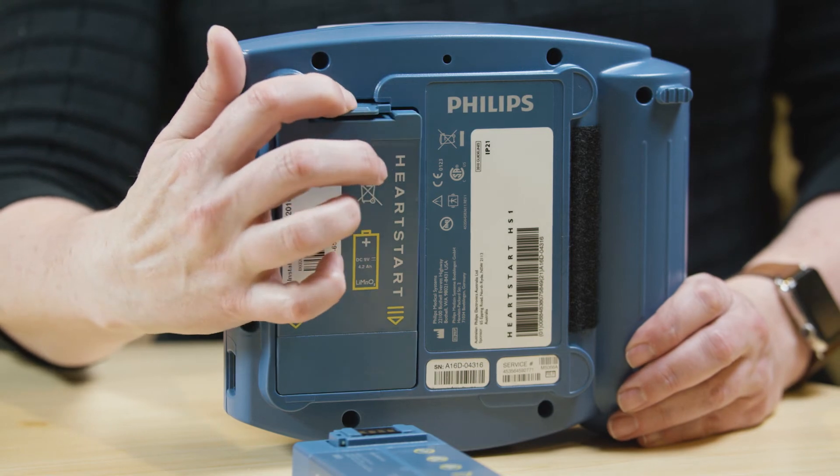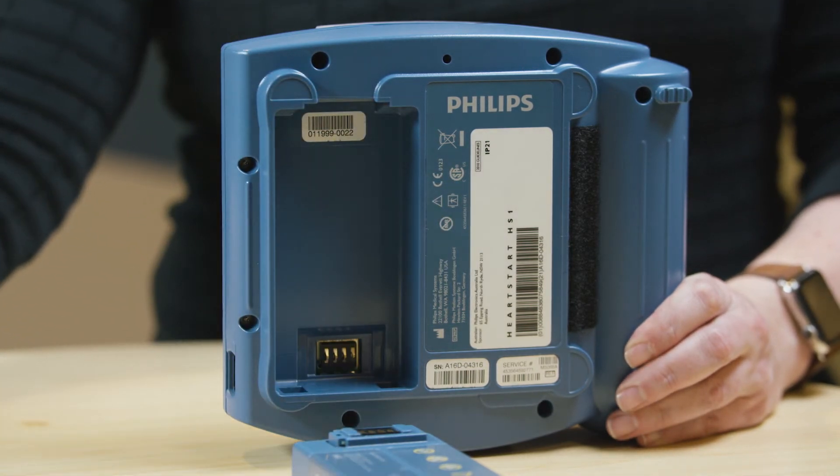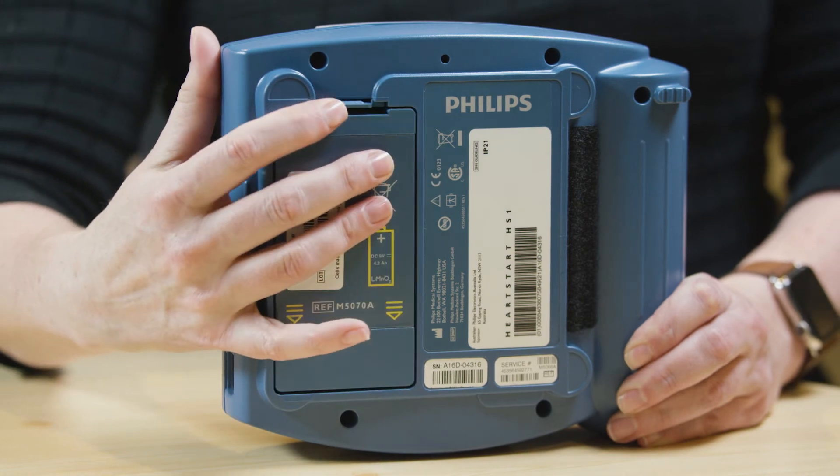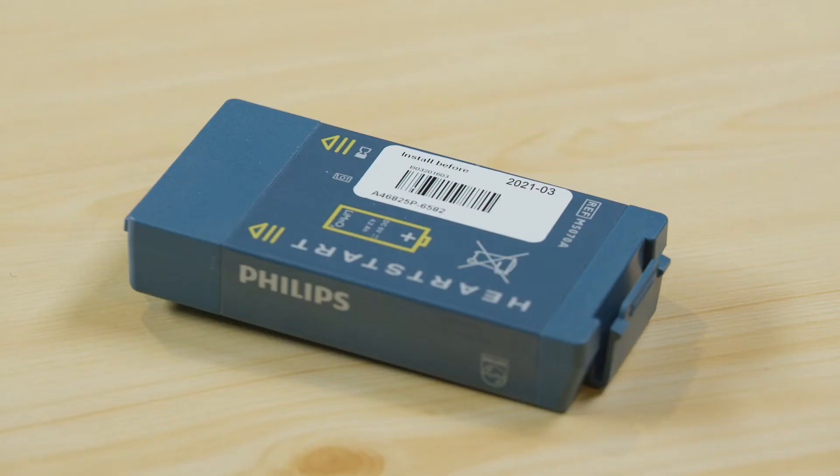To change the battery, press this latch to pop out the old battery and slip in the new battery, pressing the top end down until the latch clicks into place. The battery can be recycled at an appropriate recycling facility.